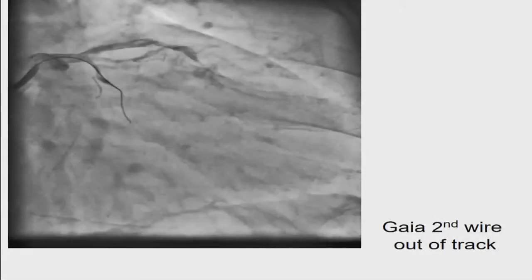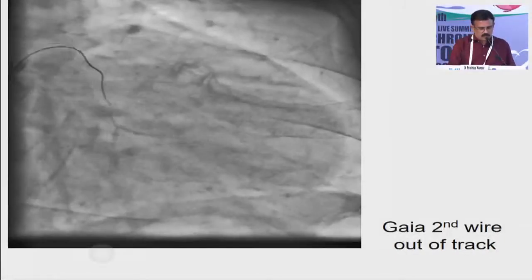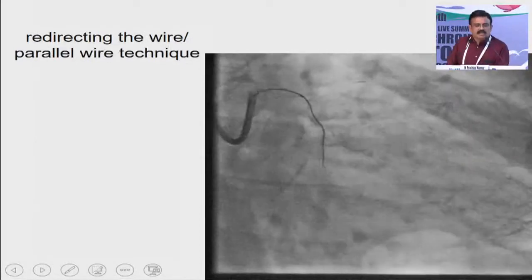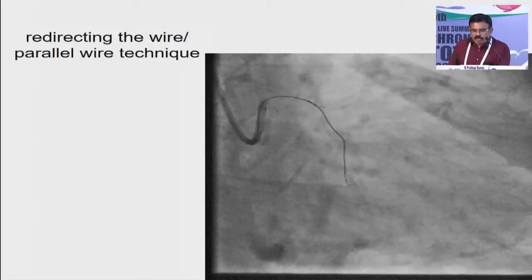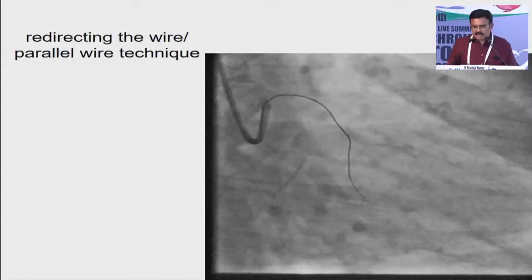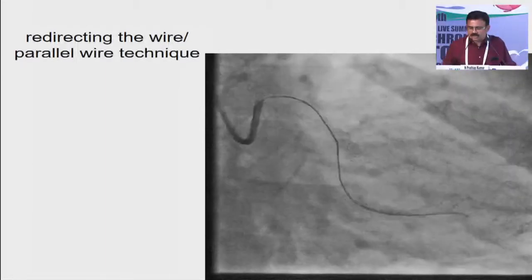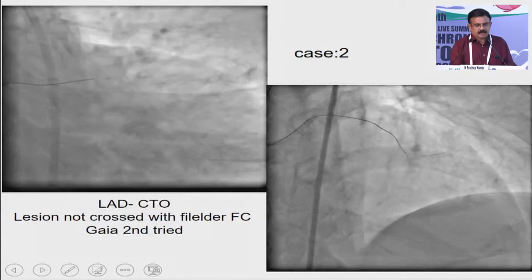Once the Gaia Second wire is out of the track, there are 2 ways to come out of this. One, you can have a parallel wire technique, or you can redirect the wire. I decided to redirect the wire because then I can save 1 wire and just finish with a single wire. So I redirected the wire, with a dissection in the proximal part, and crossed the lesion. This is a simple way of doing it. Go to the next case.